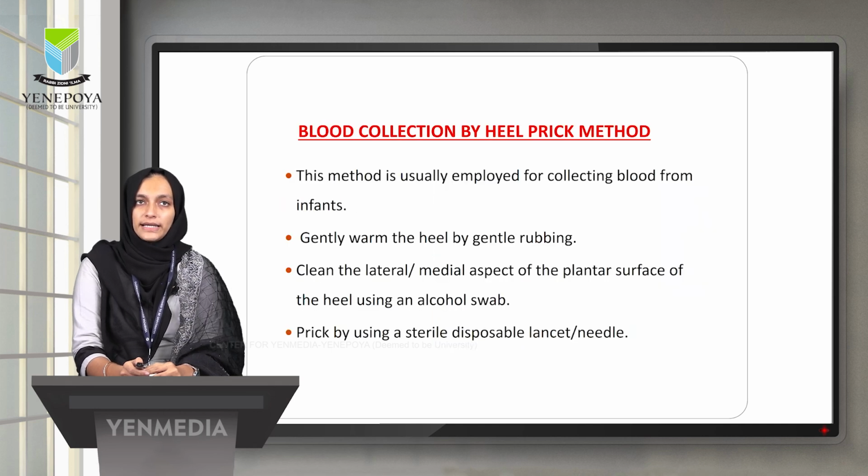Next one is blood collection by the heel prick method. This method is usually employed for collecting blood from infants. Gently warm the heel by gentle rubbing, then clean the lateral or medial aspect of the plantar surface of the heel using an alcohol swab, then prick using a sterile disposable needle or lancet.